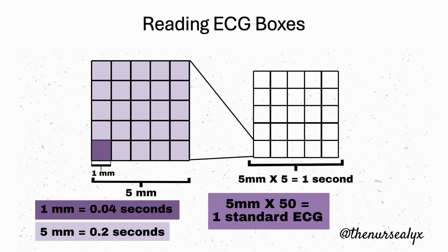For instance, if you see a heart rhythm that doesn't look very good, but I'm not sure if it's life-threatening or not, and I'm alone tonight, you can call the physician, and the physician asks, all right, what does it look like? Well, if you know what all these waves are, you could say, oh, well, I don't see a P or a T wave. It looks like a QRS, but it's huge. So you can say things like that, and you might not know what the rhythm is, what we might call it, but you could describe it, and that would be a lot better than nothing.